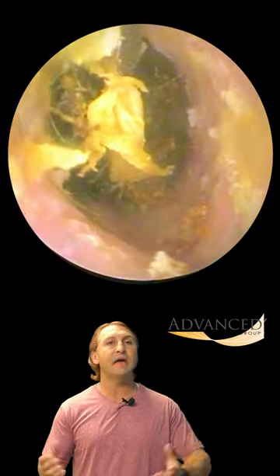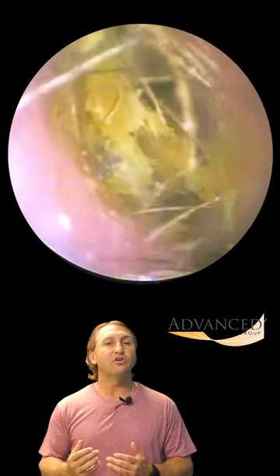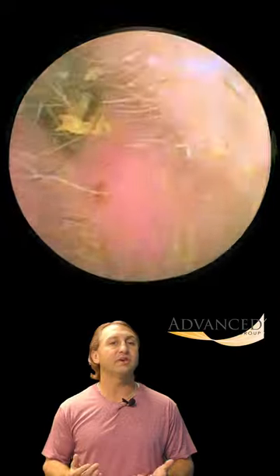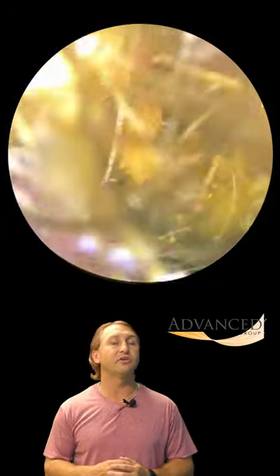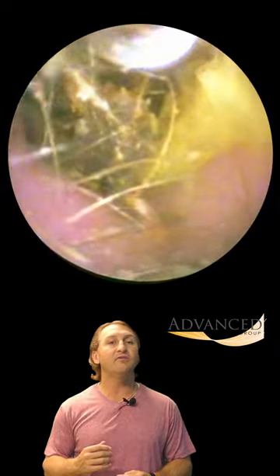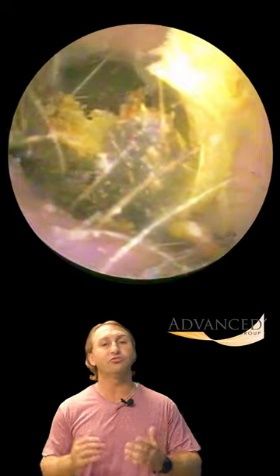Your ear canal is really tiny. This is massively magnified. We're being very gentle with very soft, deliberate movements to lessen the amount of discomfort that a patient has. This patient wasn't experiencing any discomfort, at least none that they reported, but it can be very uncomfortable if you stick something too deep in your ear. So please don't try this at home.